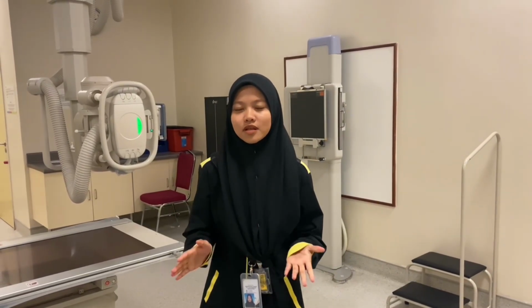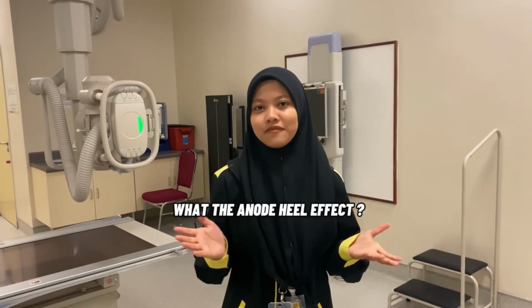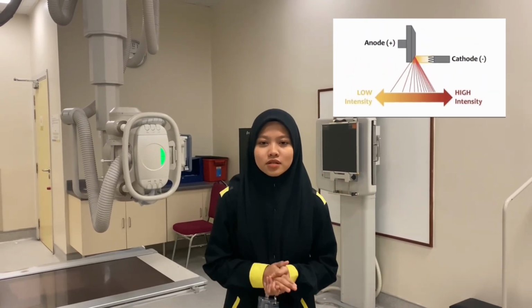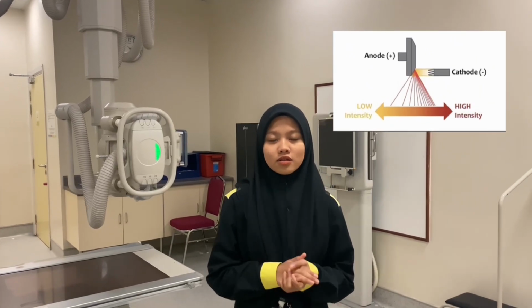I'm going to present about the anode heel effect. So what is the anode heel effect? The anode heel effect describes the phenomenon where the X-ray beam is more intense on the cathode side of the beam, which is closest to the cathode, and less intense on the anode side, which is near the anode heel.